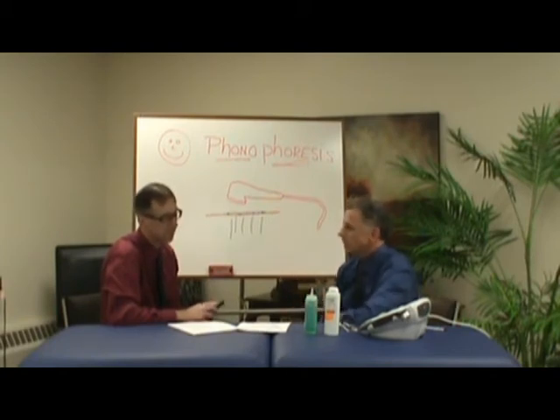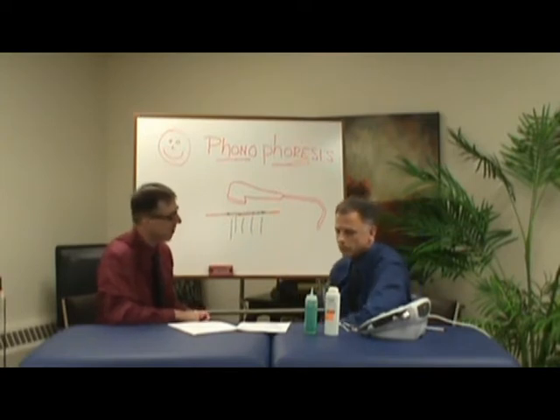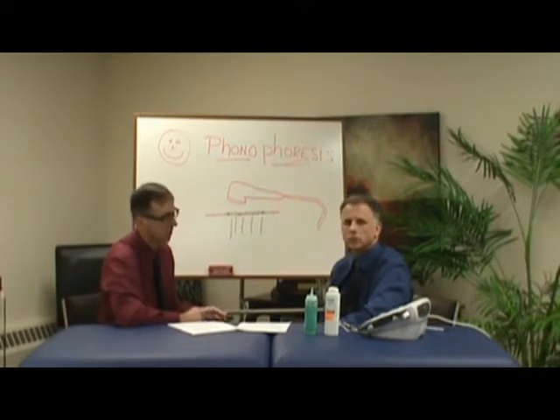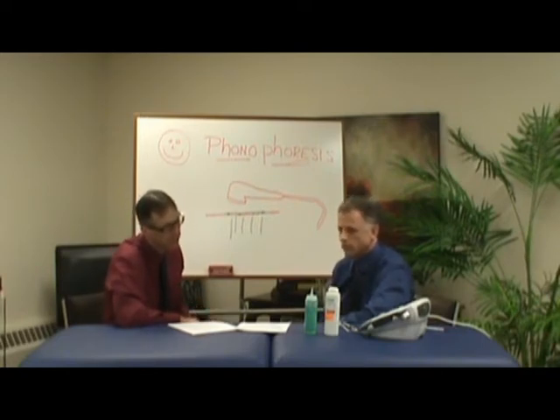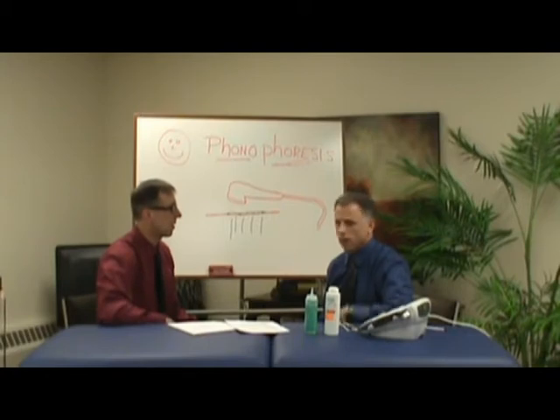Any open skin, you're going to stay away from that. Don't you want to mention these other ones? Go ahead. You don't want to do it over breast implants. You don't want to do it over epiphyseal plates, in other words, growth plates, so younger people. Eyes, cancer, as you mentioned, pacemakers, that's a big one. Thrombophlebitis, and a laminectomy site. That's on the back, after back surgery. Anything else, Brad? Otherwise, we'll go right into showing how to use it on this specific site.